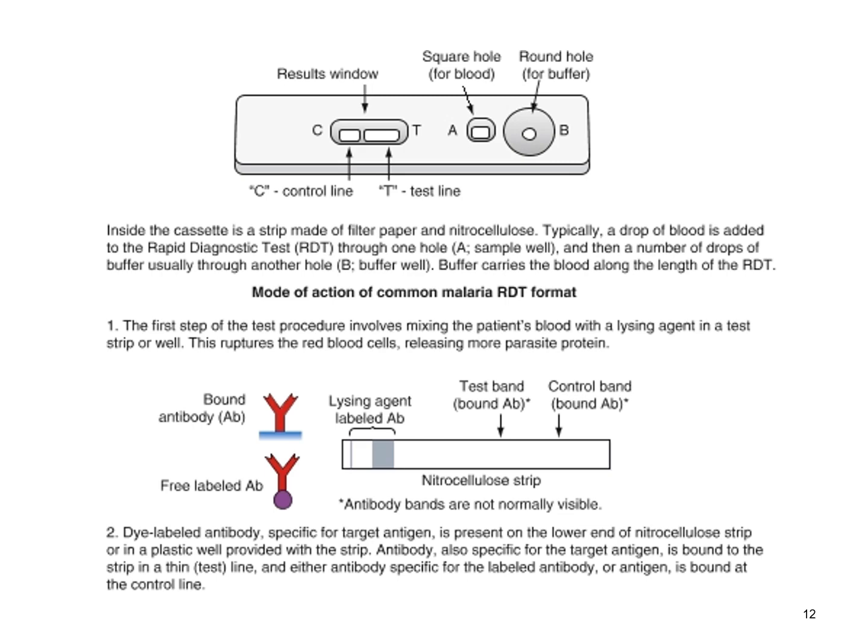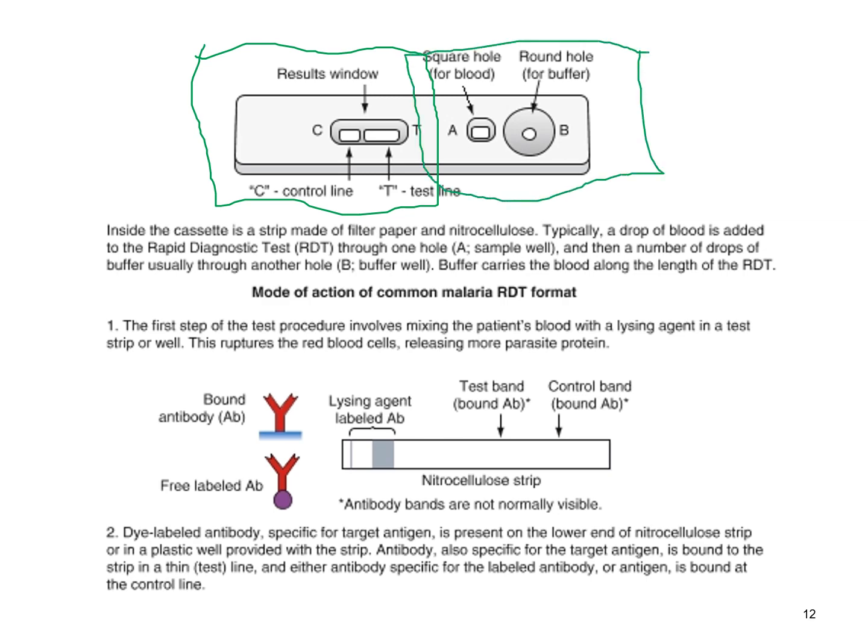This particular test here, this whole end down here is where we see our results, whereas this end to the right is where our reaction is going to take place, where we place our sample and any buffer that's required. Not all of your tests require a buffer to go onto the test strip itself. Some of them take just sample. Some of them you may have a prep step that happens in a test tube outside of this, and then you put that solution into your sample well.